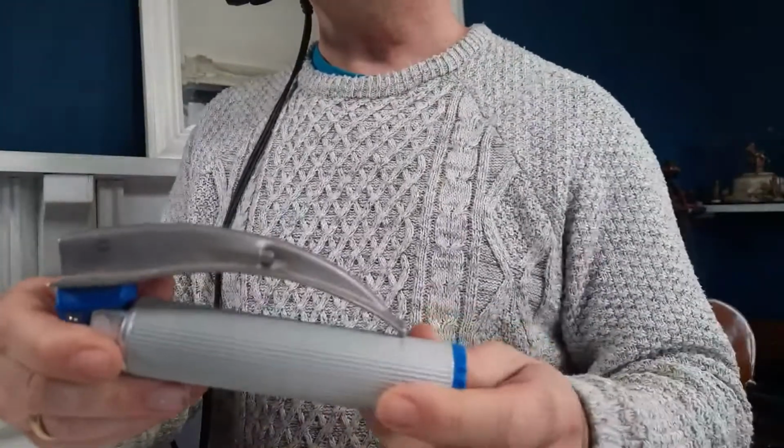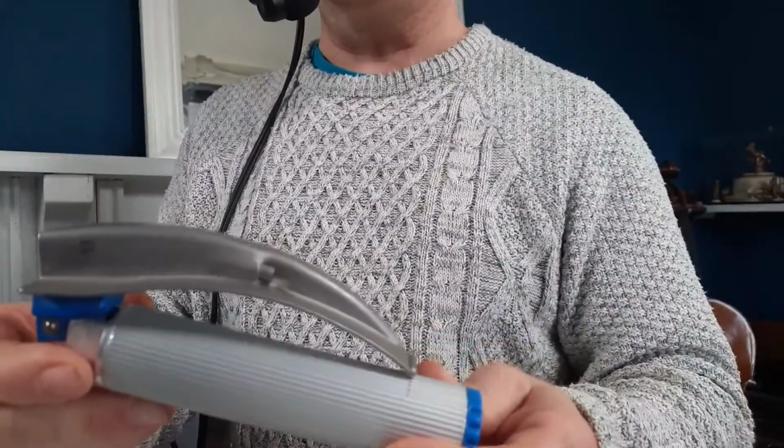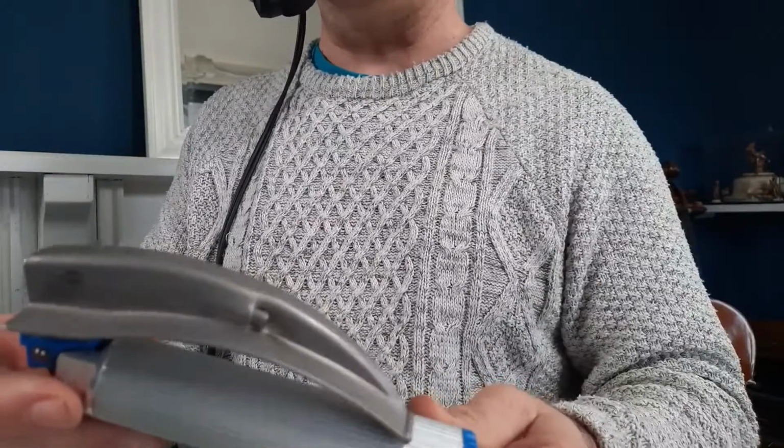So right, we're ready to intubate now. So what we need next is one of these, and I'm going to switch to another camera because I think it would be useful for you to be able to see it a little closer. So this is the laryngoscope. You can see it's got a Mac 3 blade on it.